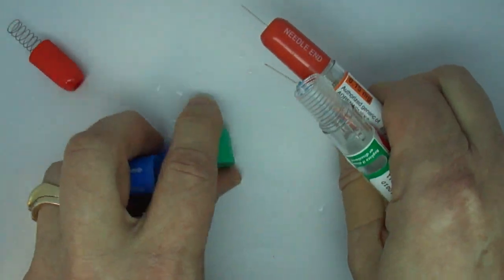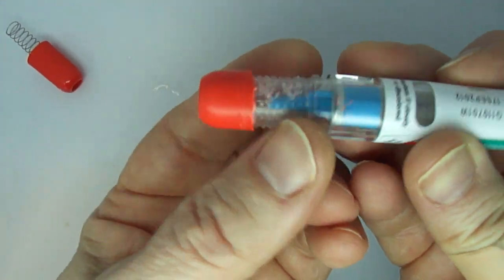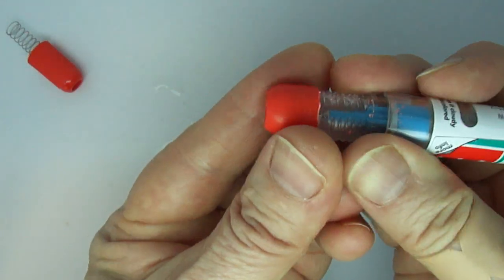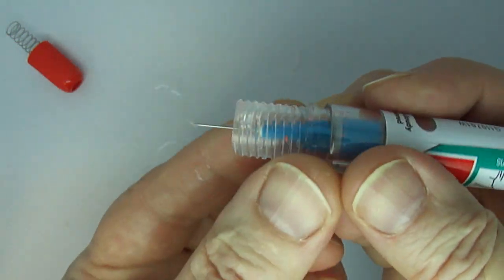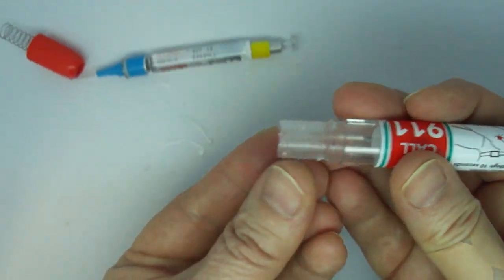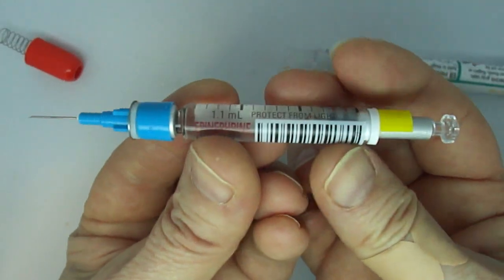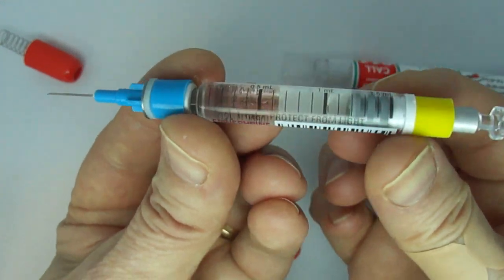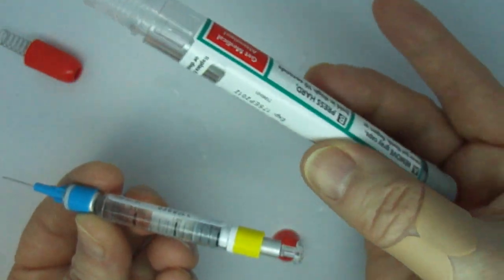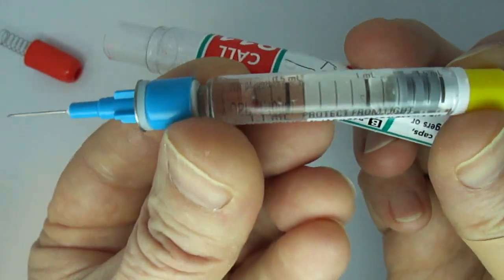And if you take off, which is quite difficult to do because it's glued on, but if you pull off that cap, it turns out it even has the little ridges underneath, like it should come off. And if you take out the insides, the vial and needle look really identical inside. This is an older version, and it even had the same markings on the inside.